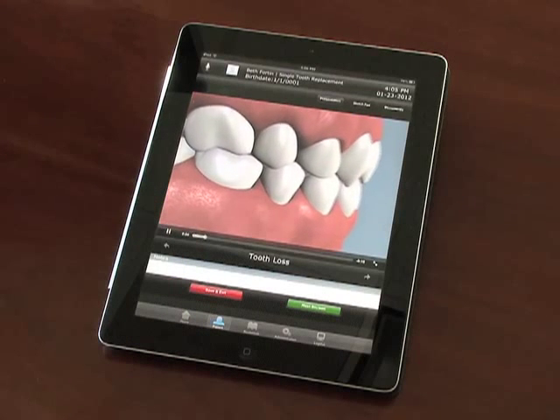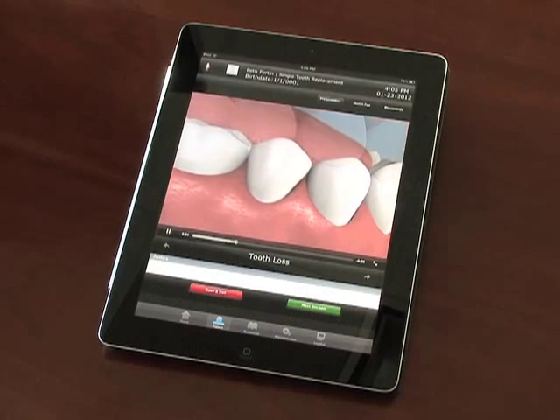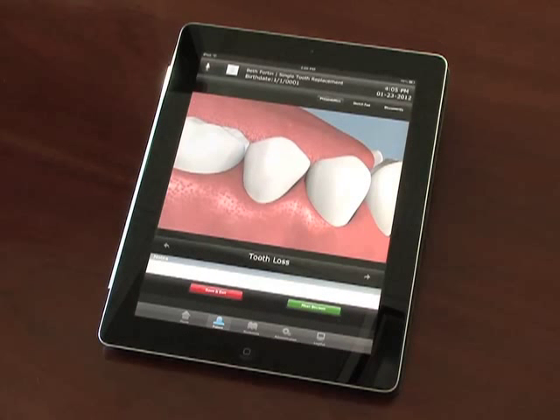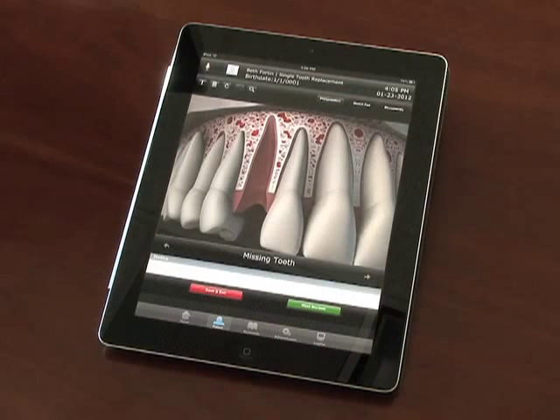You will be able to perform your consultation using video and still images which portray an incident of the patient's condition. In this presentation section, you can watch videos.